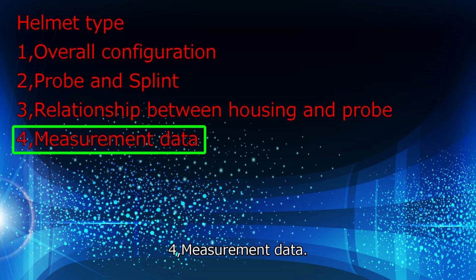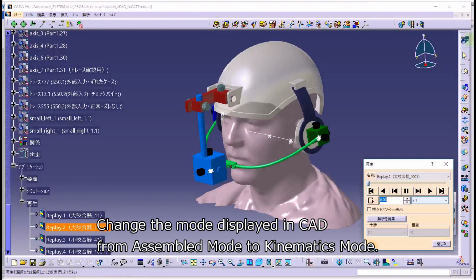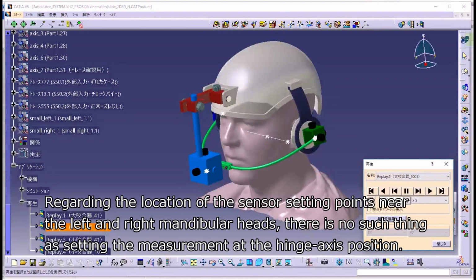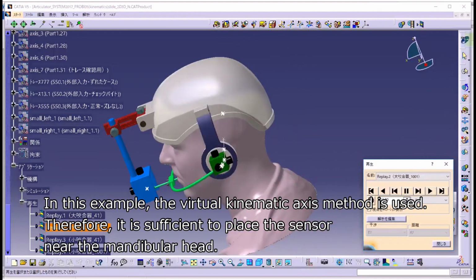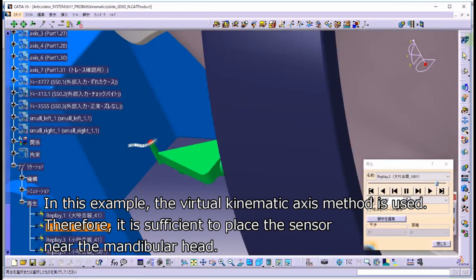4. Measurement data. Change the mode displayed in CAD from assembled mode to kinematics mode. Regarding the location of the sensor setting points near the left and right mandibular heads, there is no such thing as setting the measurement at the hinge axis position. In this example, the virtual kinematic axis method is used. Therefore, it is sufficient to place the sensor near the mandibular head.